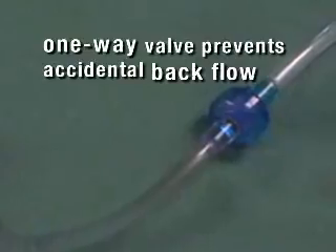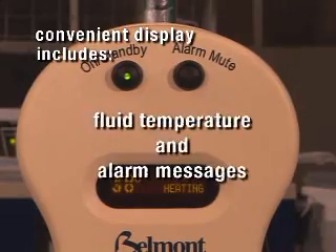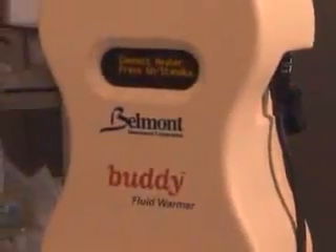It has a flow control valve to prevent air entrainment, a one-way valve to prevent accidental backflow from the patient to the IV line, and displays fluid temperature and any alarm messages on the display of its power module, which mounts conveniently to an IV pole. All these safety features work seamlessly without any operator involvement.